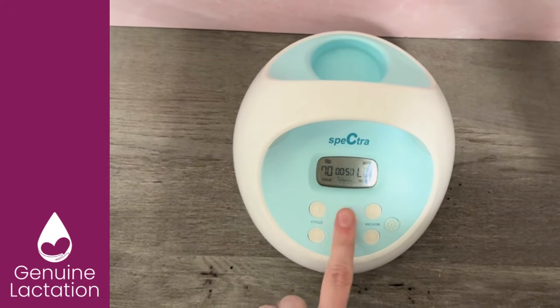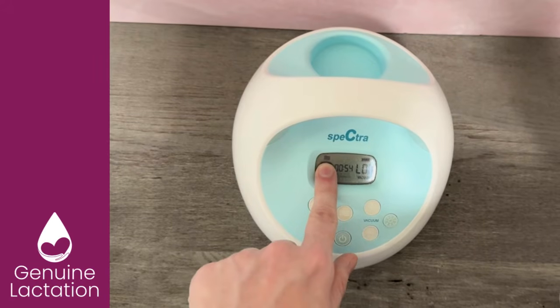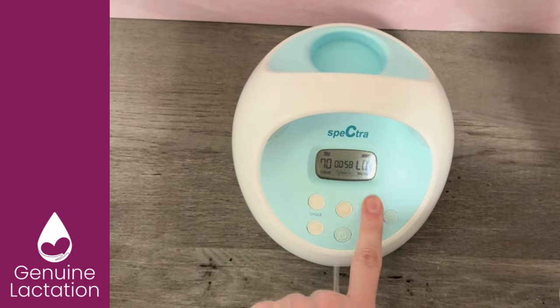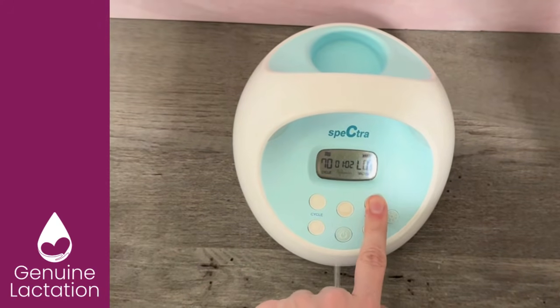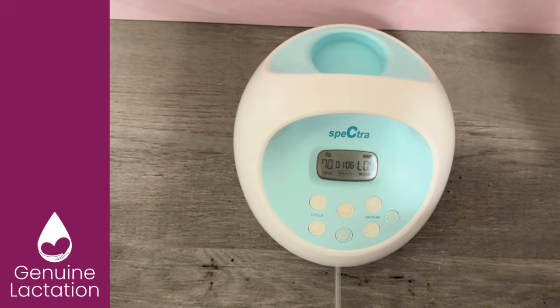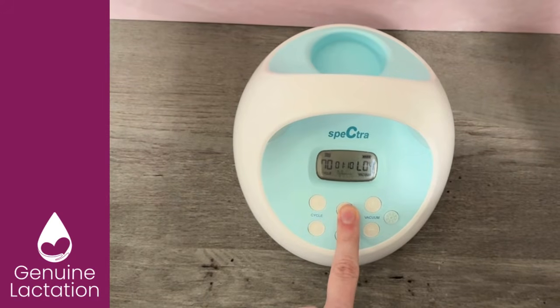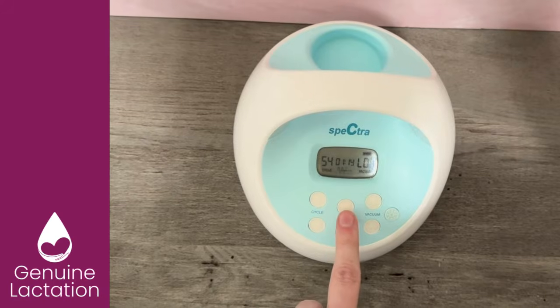So what you're going to do is start on massage mode, which is the 3 wavy lines or bacon mode. So that's going to be 70 cycles per minute, and you're going to go up every 30 to 45 seconds until you feel a good pull on the nipple and we start to see milk flow. Once you start to see milk rapidly flowing, you're going to hit this button again, and you're going to go to expression mode.